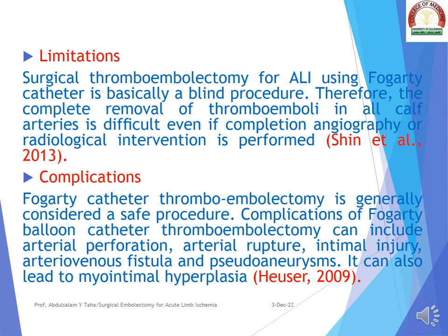Complications of Fogarty balloon catheter thromboembolectomy can include arterial perforation, arterial rupture, intimal injury, arteriovenous fistula, and pseudoaneurysms. It can also lead to myointimal hyperplasia.